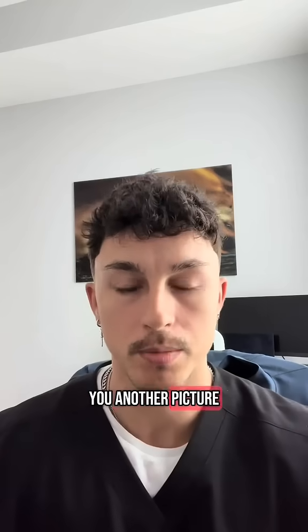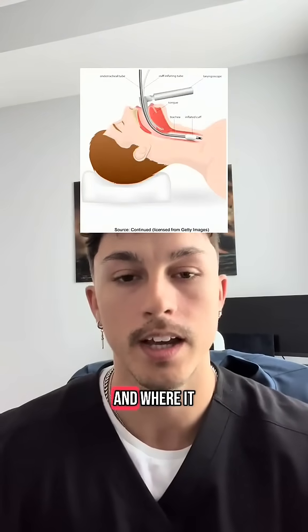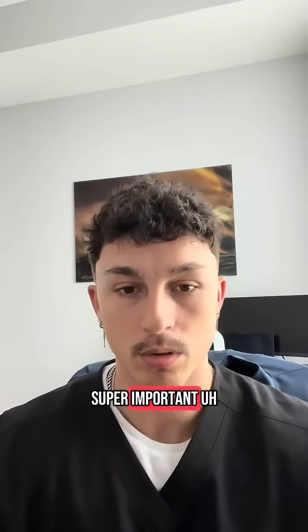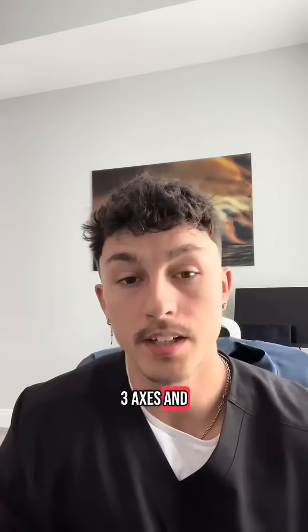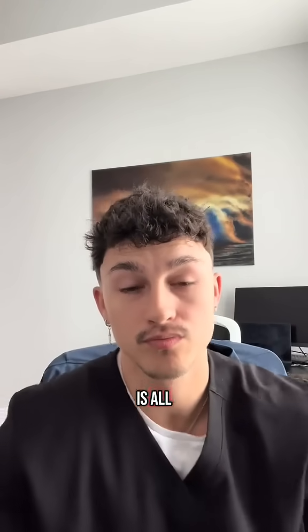And here I'll show you another picture of how that looks from the side when we're actually going to put that breathing tube in and where it sits in the trachea. So that's pretty much what we see when we put a breathing tube in someone. Again, patient positioning is super important to give us the best view and the best direct shot to the vocal cords by aligning those 3 axes and putting the patient in the sniffing position. And that is all.